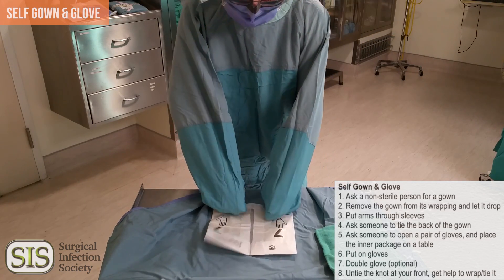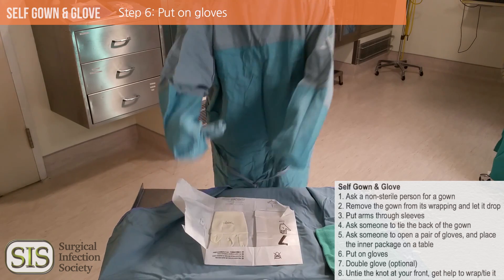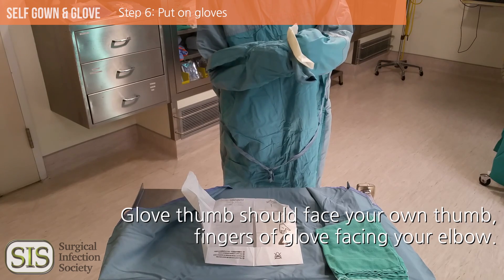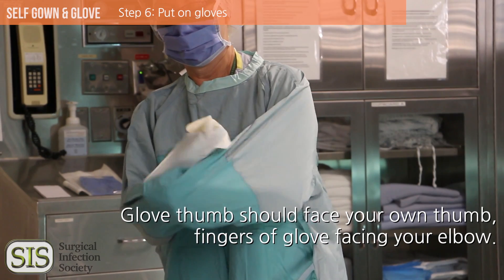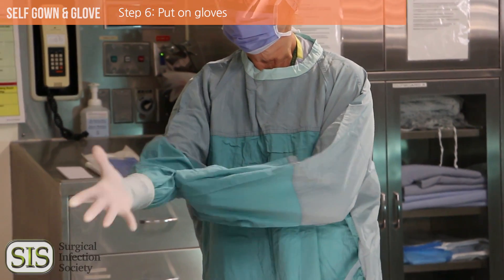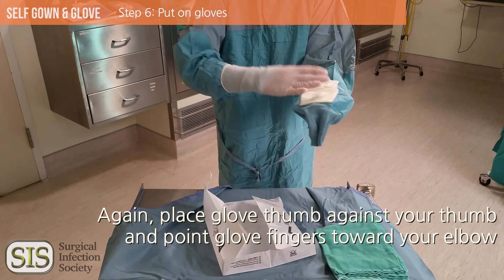Put the gloves on. Pick up the right glove and place it on your right sleeved, wrapped hand, with the thumb facing your own thumb and fingers facing your elbow. Use your right fingers to hold the cuff of the glove and use your other hand to pull the glove over your hand. Adjust the sleeves and gloves by pulling up your right sleeve using your left sleeve-covered hand. Repeat the process to glove your other hand.